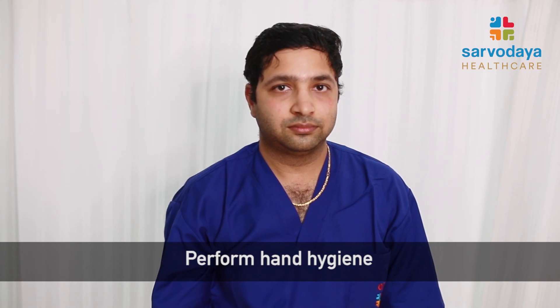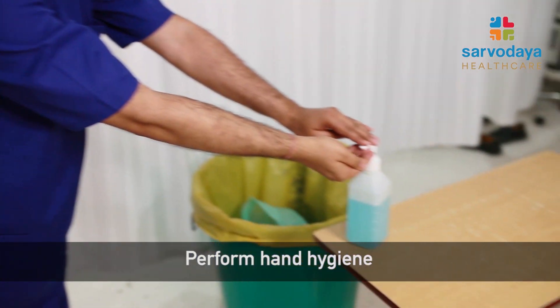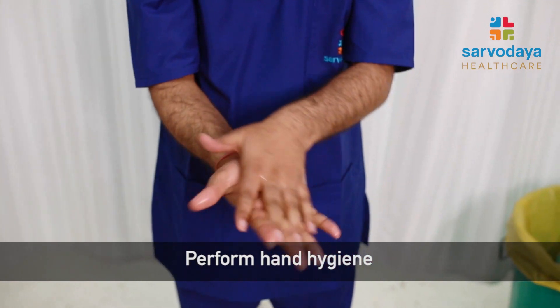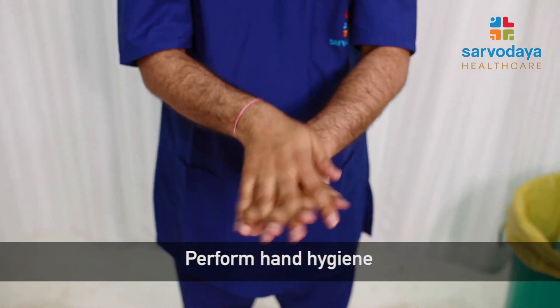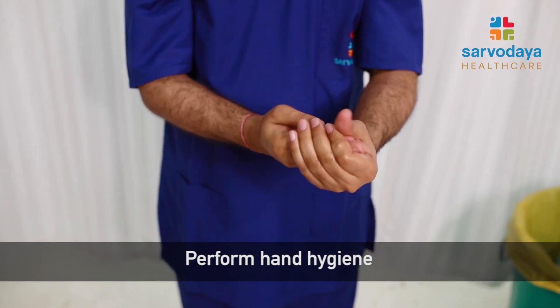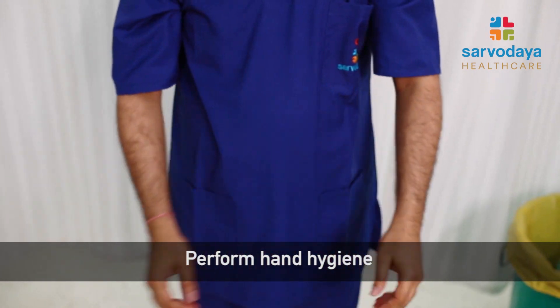Once the entire PPE is removed, it is very important to perform hand hygiene for at least 20 seconds. All the steps are very important. After completion of each step, one should ensure that proper hand hygiene is done. This is how we perform the doffing procedure.